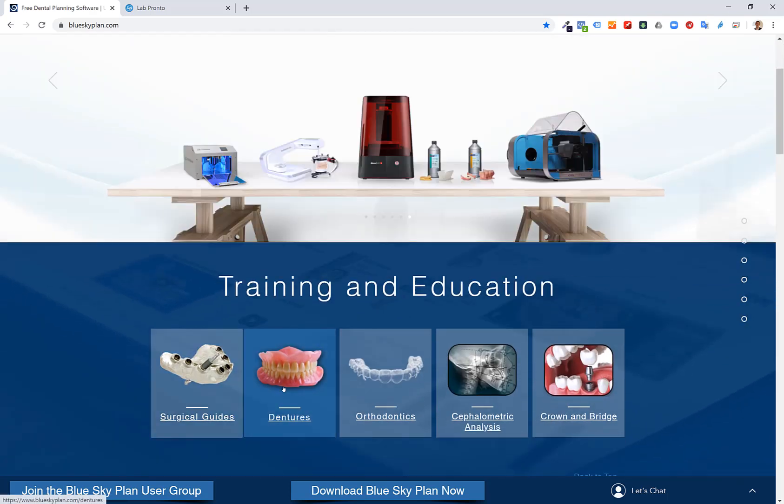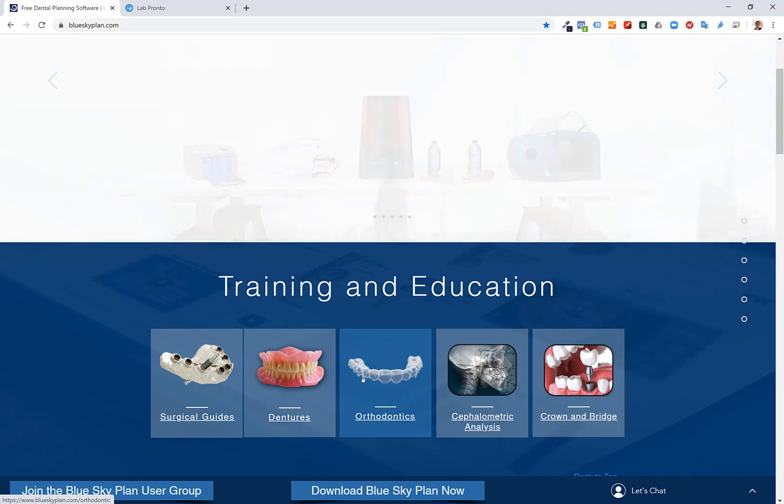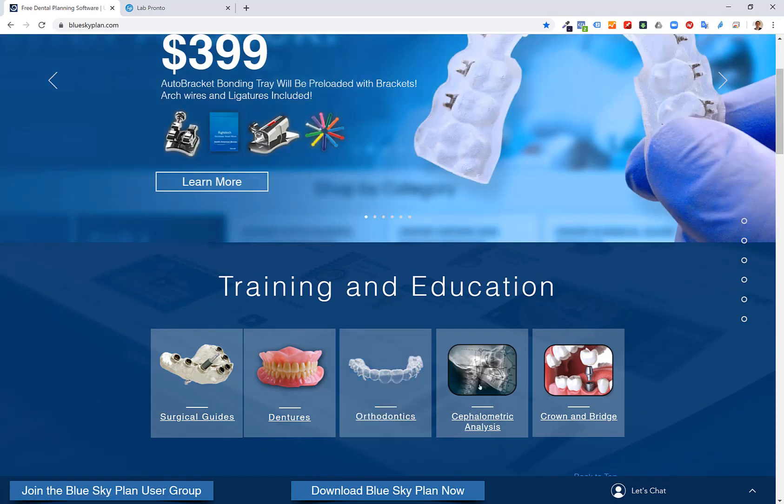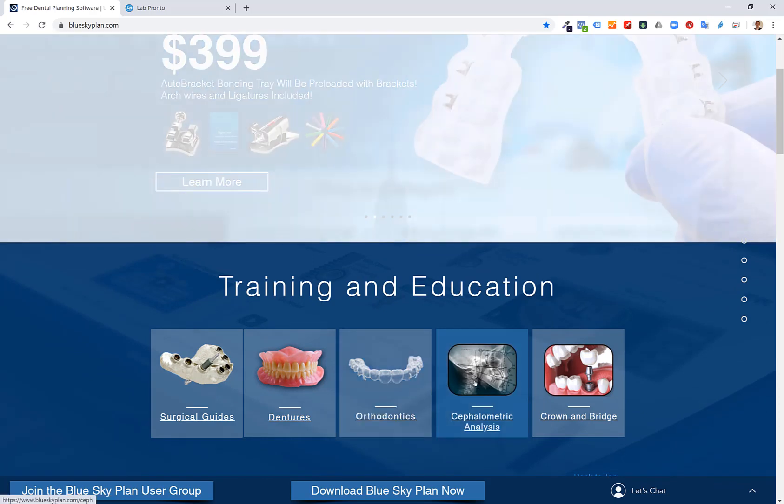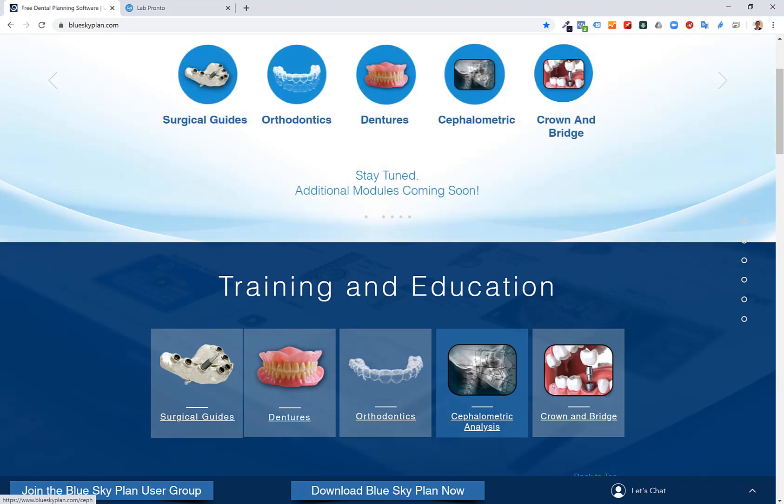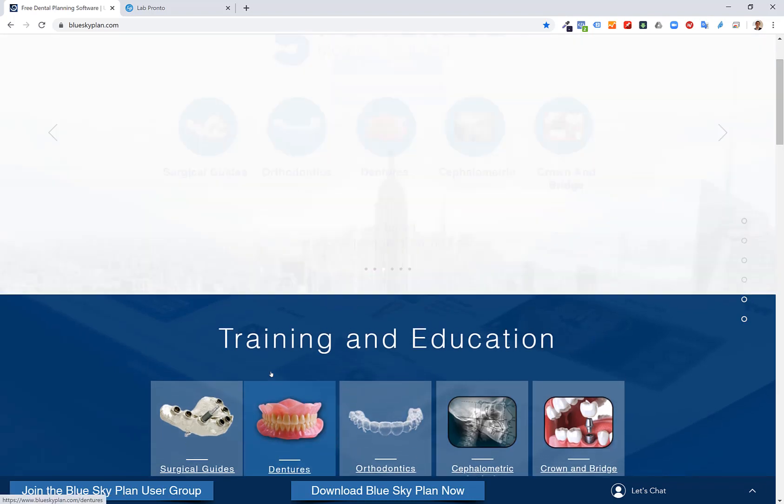Clicking on a particular module will give you access to training tutorials such as these, as well as sample data files that you can use to follow along to the actual training tutorials.